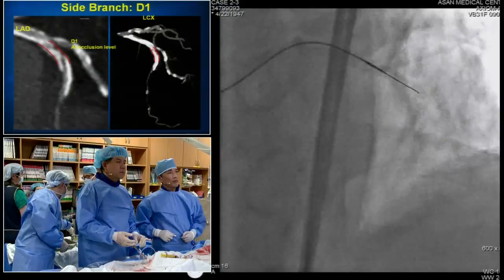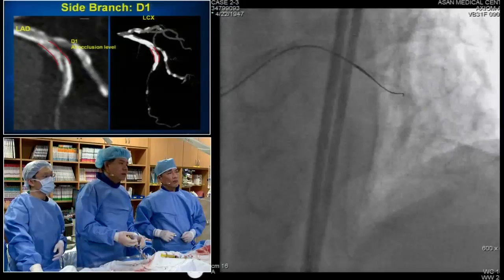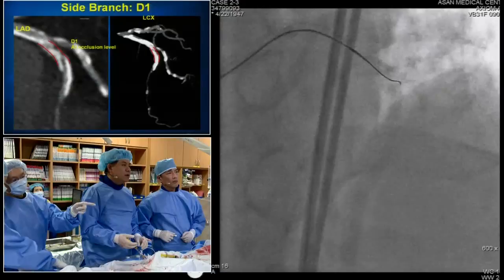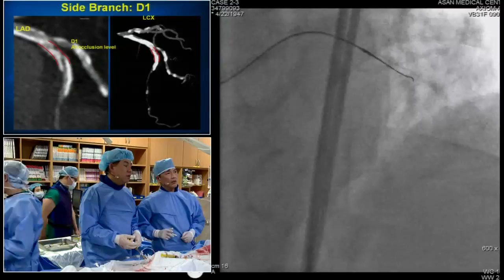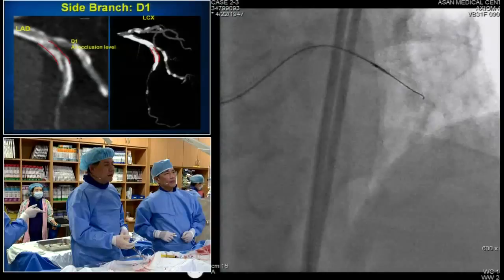Because the right coronary contrast injection is not helpful for our situation, so we disengaged and a little bit pulled out the right guiding catheter. And Dr. Muramatsu appears to be feeling some roughness between septal and diagonal branch, right? Yes. Now we are attacking the entry point by the Gaia Second, between septal and diagonal, anterolaterally.